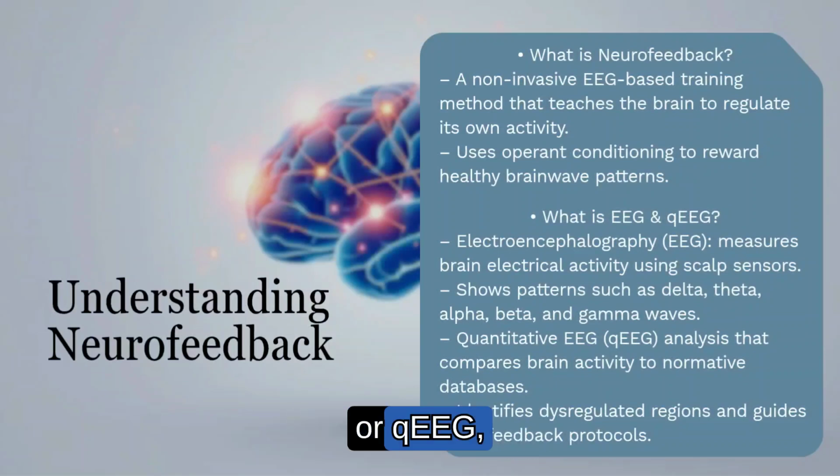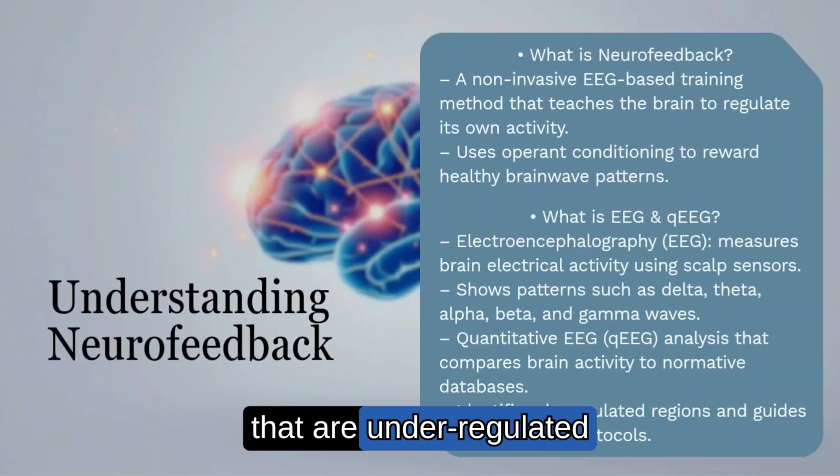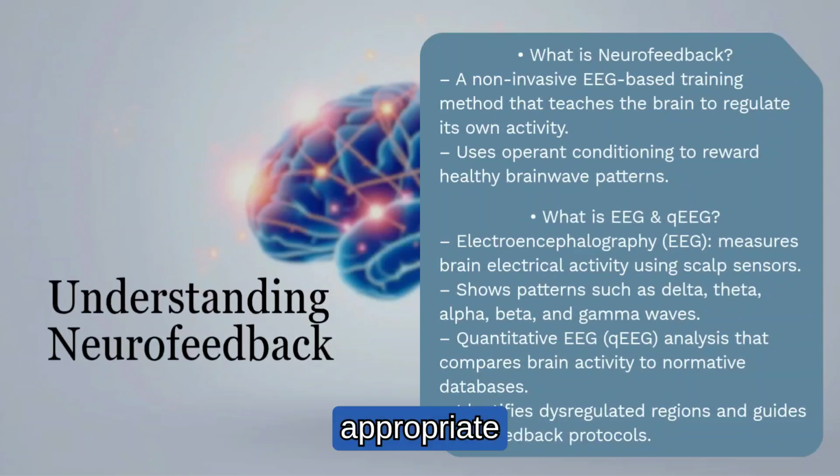Furthermore, quantitative EEG, or QEEG, provides a deeper layer of scientific analysis. It uses advanced software to compare a person's brainwave patterns to a large normative database. This helps identify regions that are underregulated or overactive, guiding practitioners in choosing the most appropriate neurofeedback protocol.